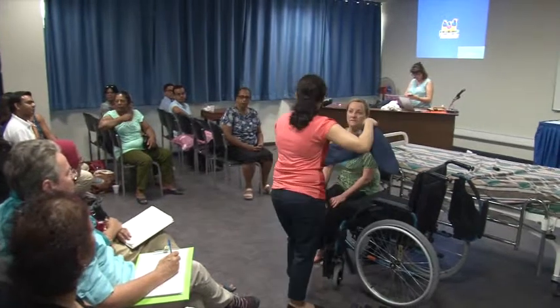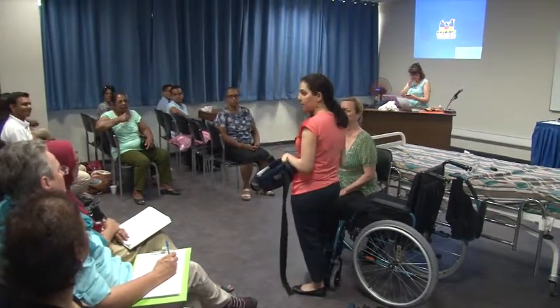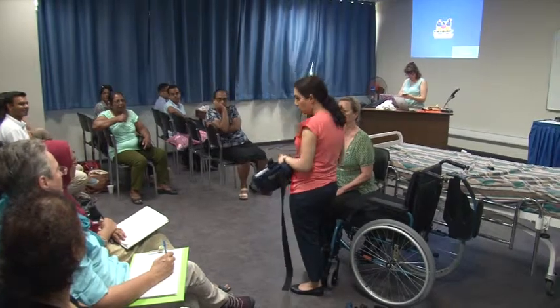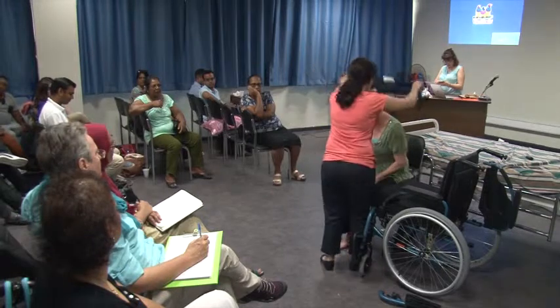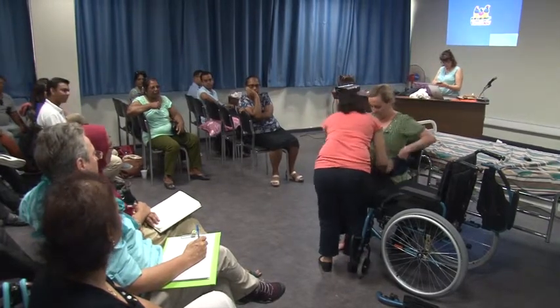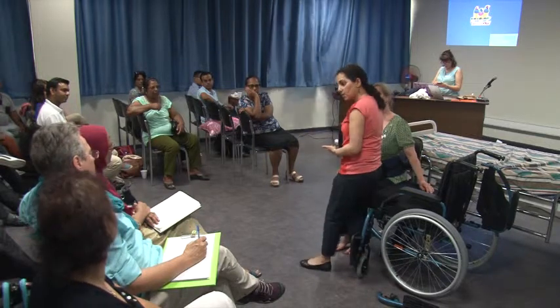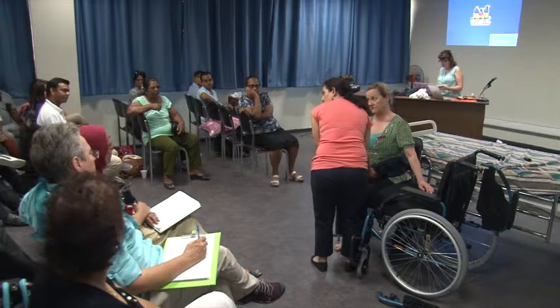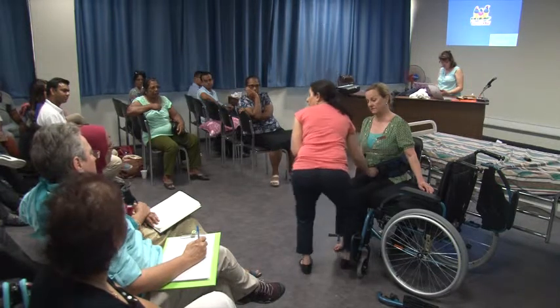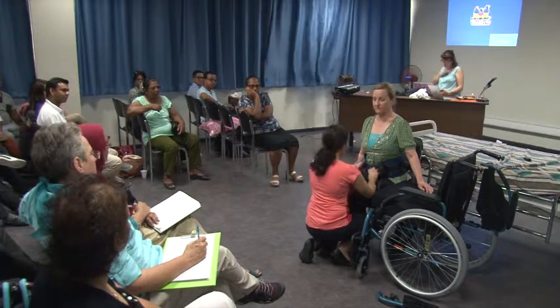So again, this transfer is for a particular type of people who have the ability, not a highly dependent person. So you would get this around them. You could do that when they are in a better position, maybe lying. And see, the surface is low. How am I going to protect my back? That is a bad position to be in. For me, I think this is where I go down. I can keep my back straight.